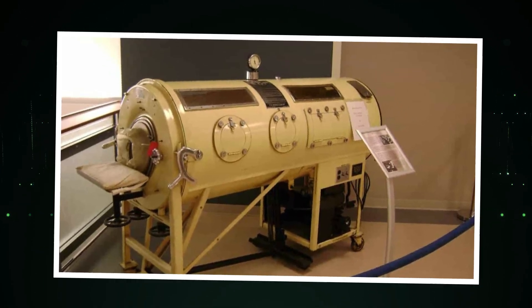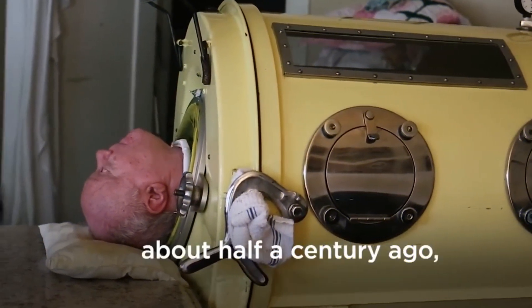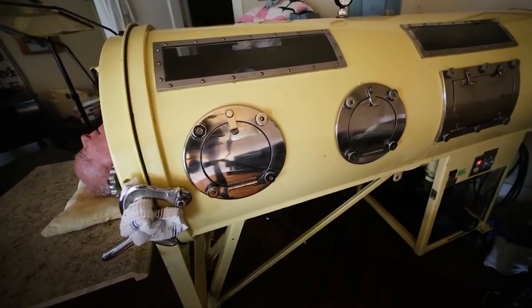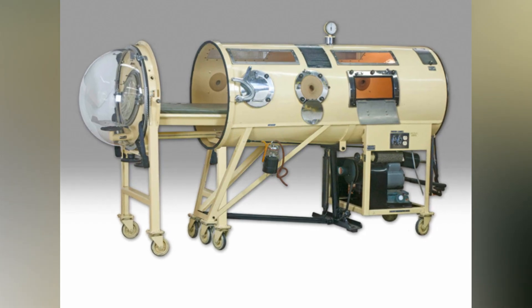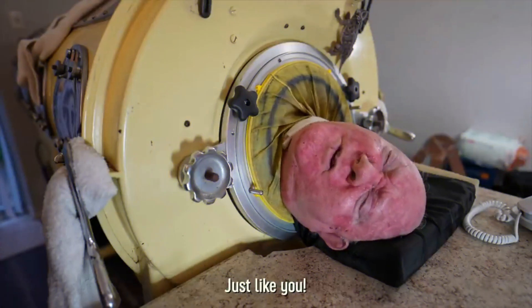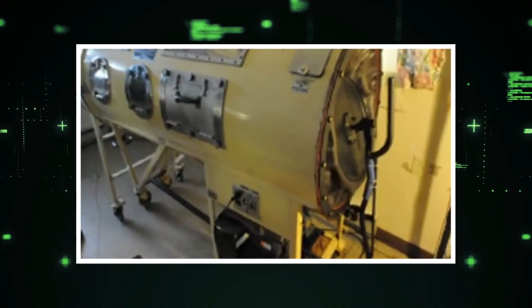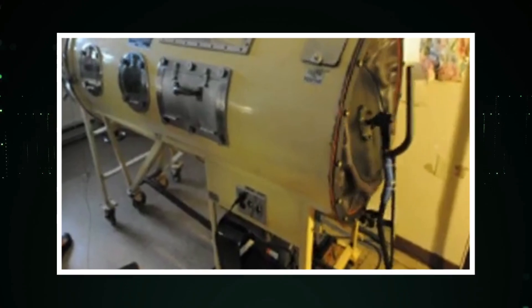Today, iron lungs may be largely obsolete, but they remain an important reminder of the medical breakthroughs that have helped shape our world. Do you know how an iron lung works? If you've ever seen a picture of one of these massive metal cylinders, you might wonder how they were able to keep people alive. The answer lies in the complex mechanics of the pump that creates negative pressure inside the chamber.